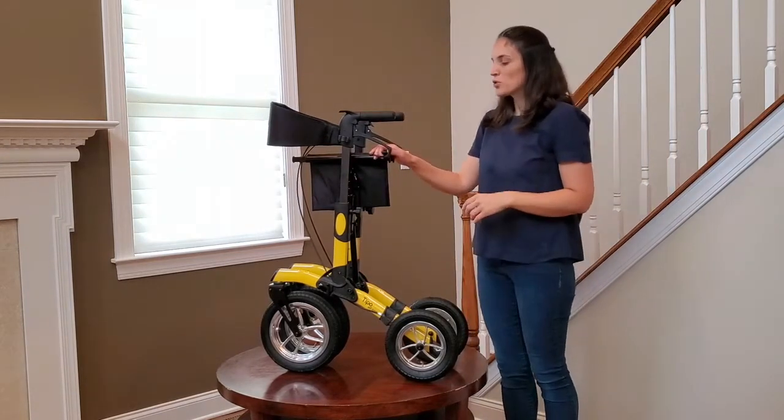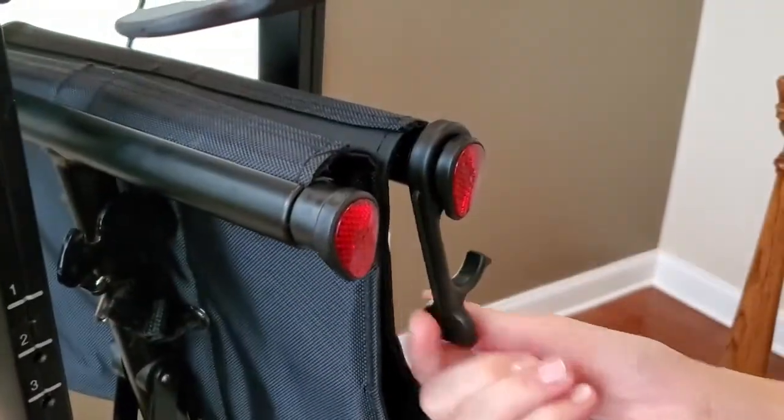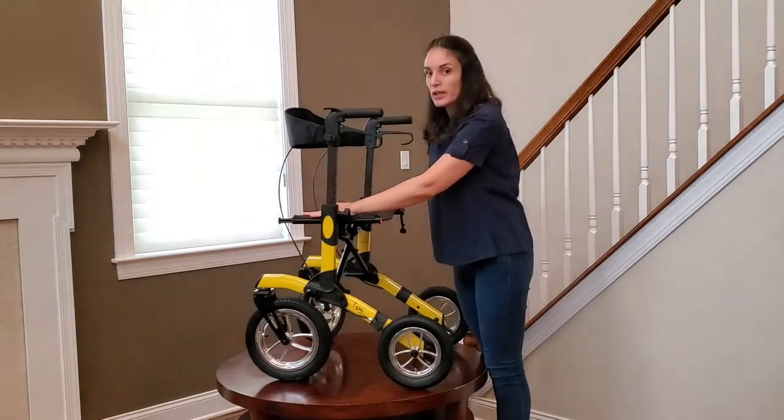Now find the plastic support that is holding the seats together. Open it up and spread your seat apart and push it down until you hear a clicking sound.